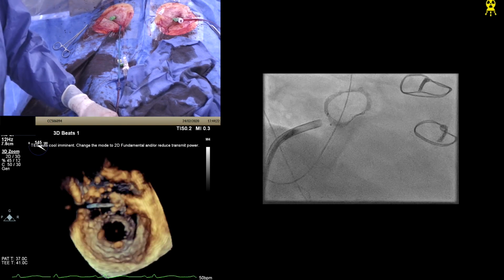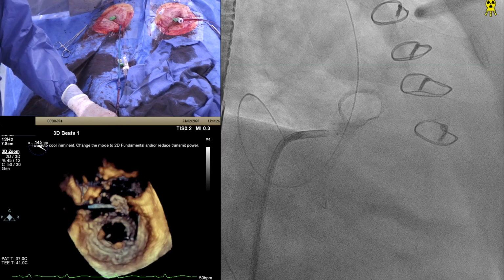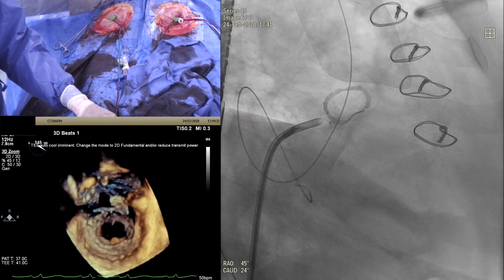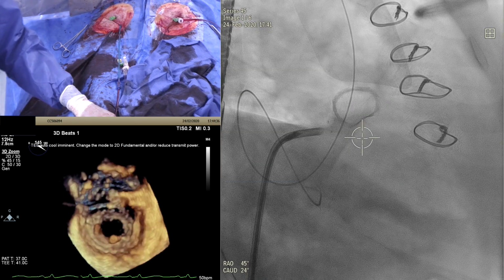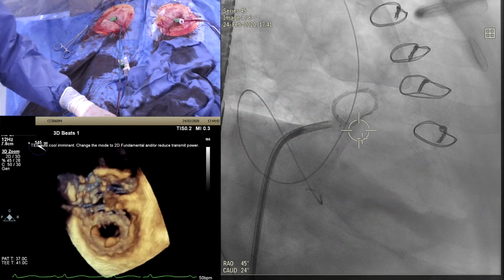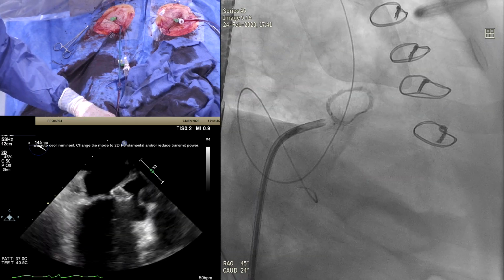It looks on fluoroscopy. Can you open up the tops and bottoms a bit? Thank you. So, to be honest, it looks fine. That's fine then. It looks okay. Or maybe if you go to 2D, because maybe there's tissue, that might be dropout. Go 2D. Okay, and just see how far away we are, because that might be just dropout from tissue. Yeah, look. Oh yeah, no, you're right.